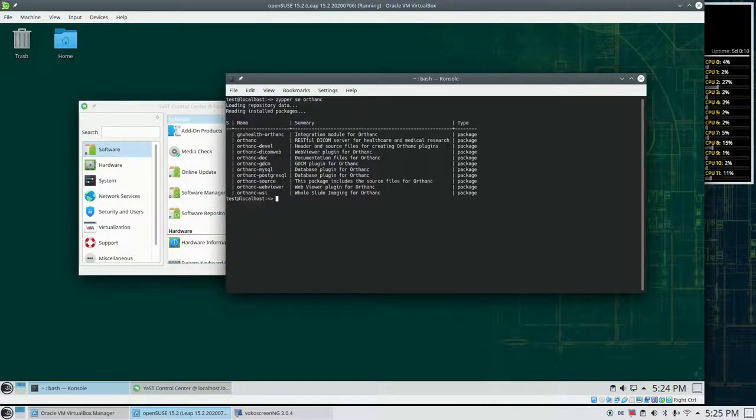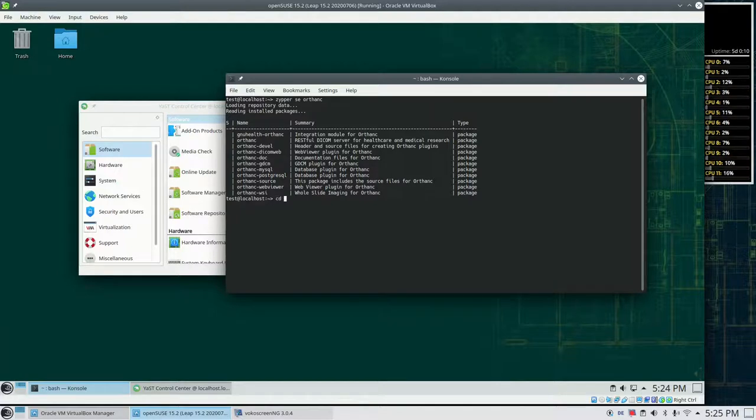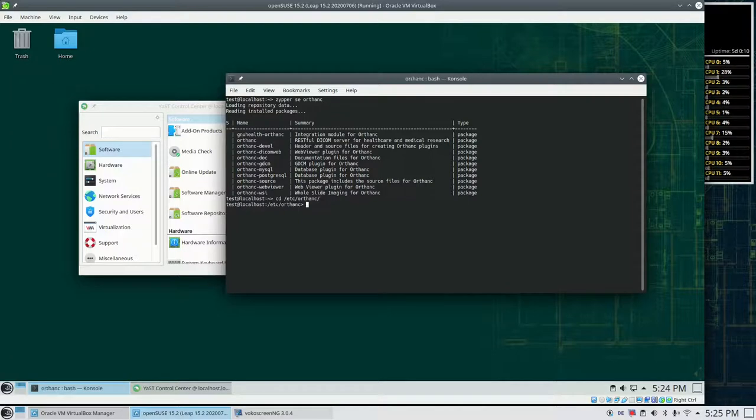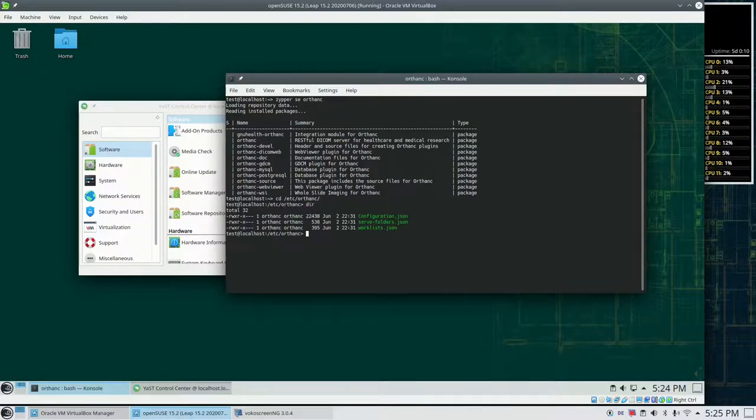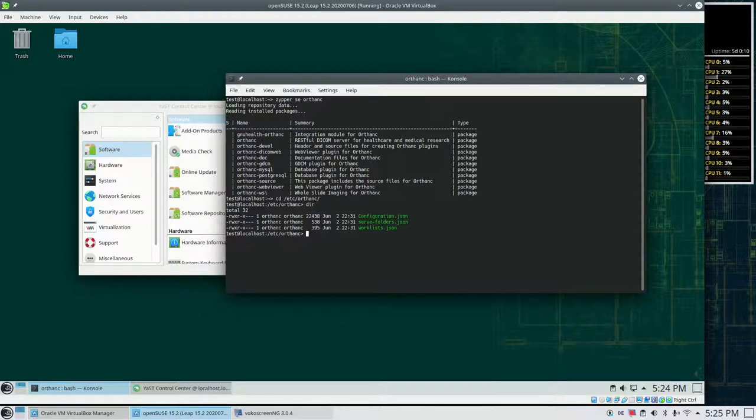We should take a look at the configuration files. They are in /etc/orthanc. There is a configuration.json, a serve folders, and a worklist.